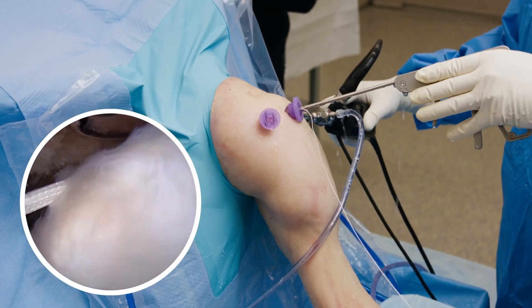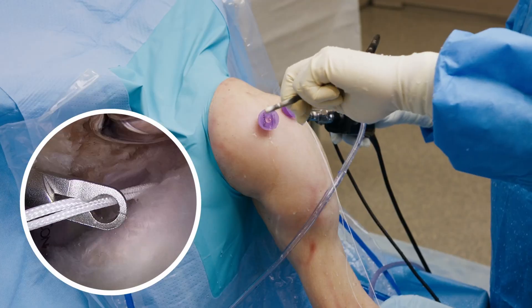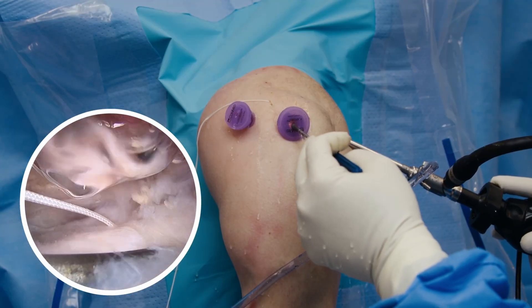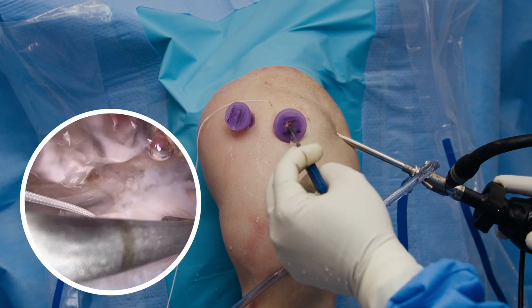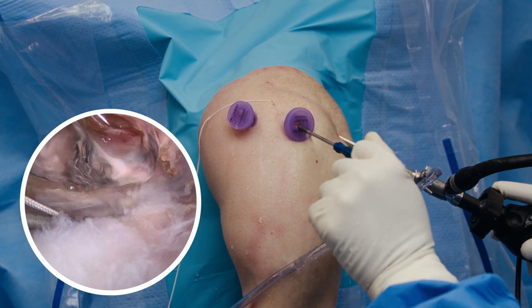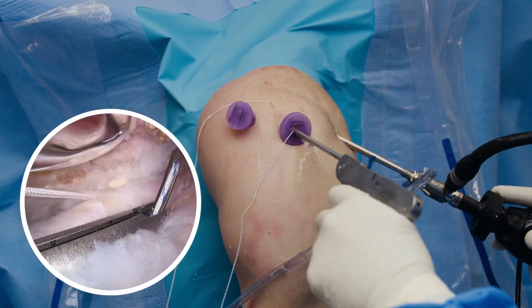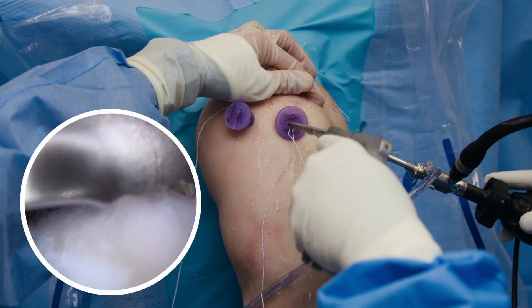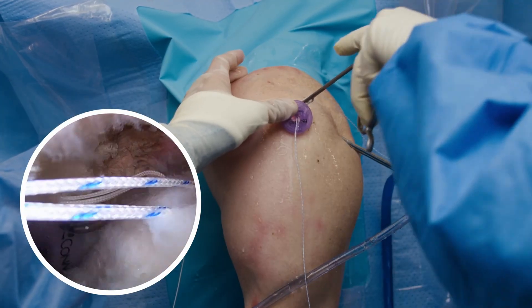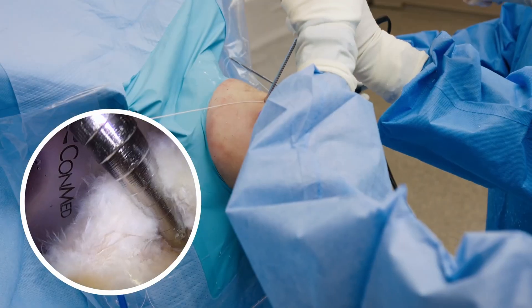We're going to begin this procedure by placing our medial row anterior augmentation sutures. These white sutures are going to be retrieved through an accessory portal to maintain suture management. I'm now using an arthroscopic probe to measure the distance between the anterior medial fixation suture point and the posterior fixation suture point. I'm now placing these blue-white sutures through the posterior location, which we'll use to secure the biobrace medially. These sutures will also be retrieved through an accessory portal to maintain suture management.